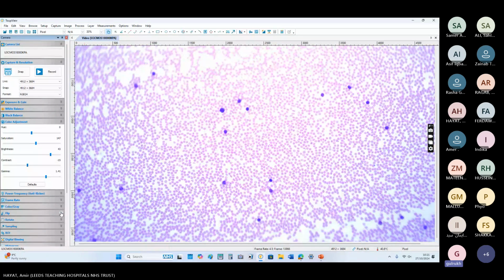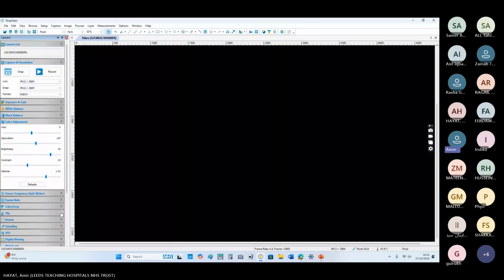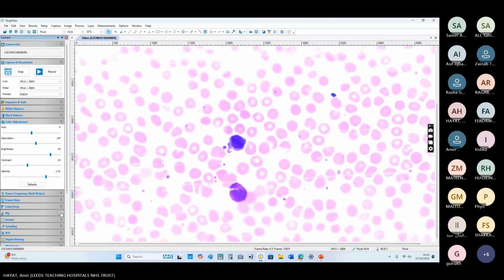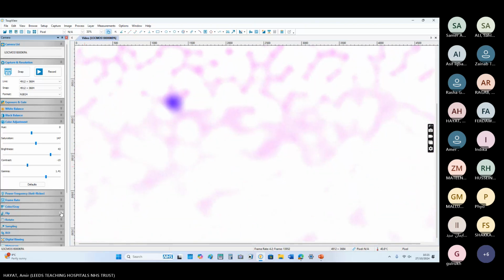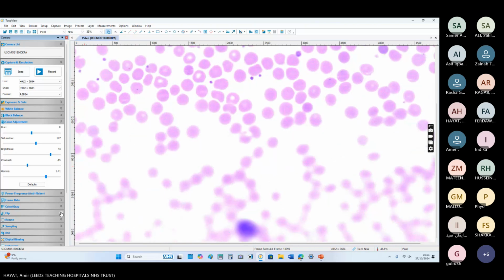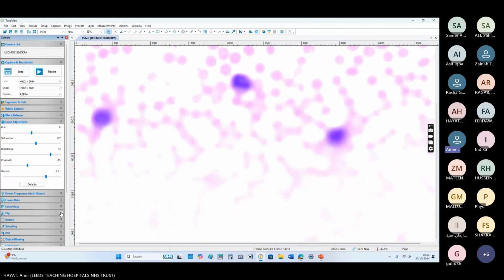Sir, please zoom a little. Okay. I will go to power 50. Let's see a few cells and then you can comment on that.